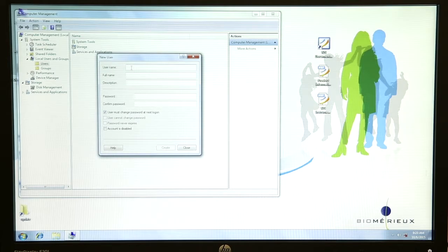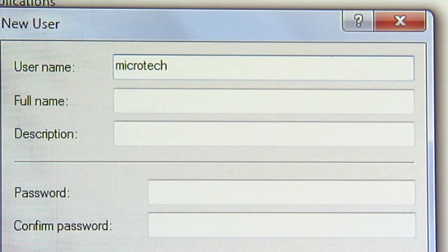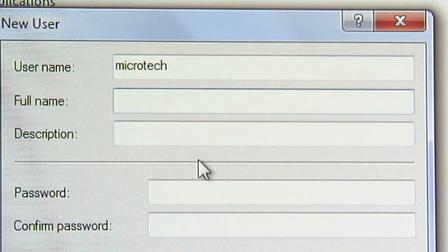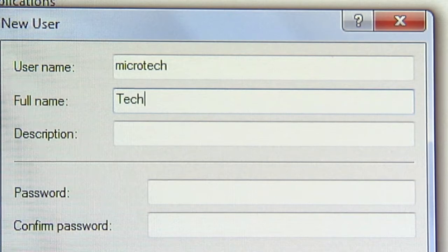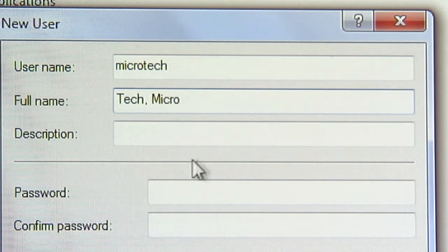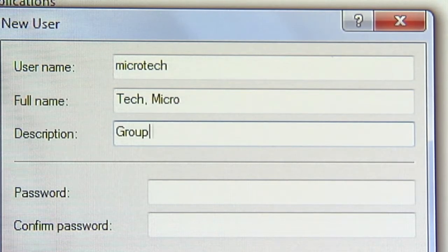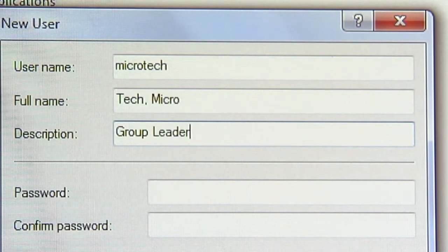In the New User window, enter a user name — for example, type Microtech. Enter the full name following the format of last name comma first name; in this case, Tech comma Micro. The full name should be less than 40 characters. A description of the user is optional; for this user, we will enter Group Leader.